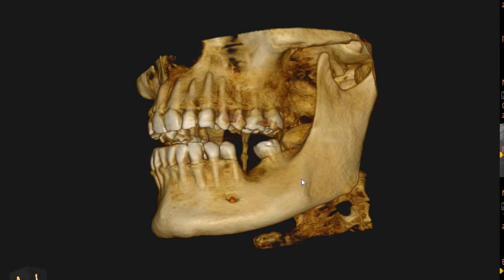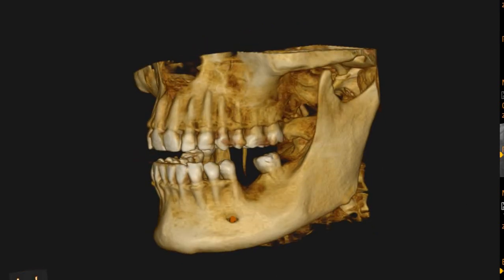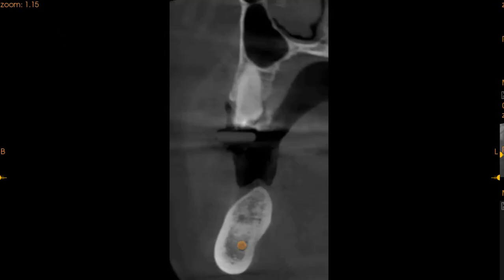We've placed an implant for you in this region. On the trans-axial view, which is basically the proximal view, you can see that we've got a slightly angular mandible but we've got adequate bone support. The bone quality is D2 in this region. We've got good cortical plates with a healthy cancellous bone.